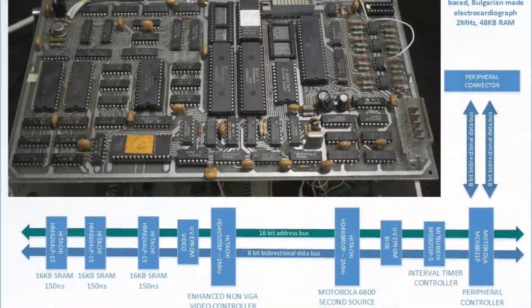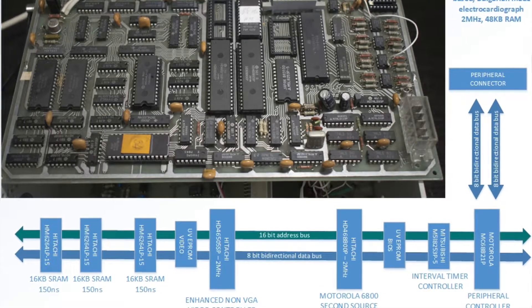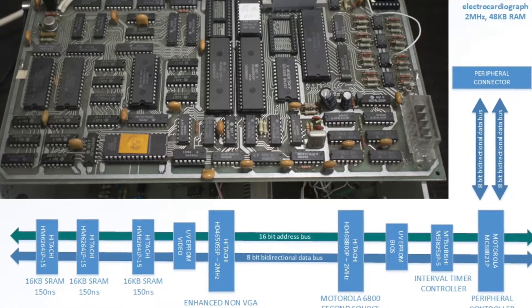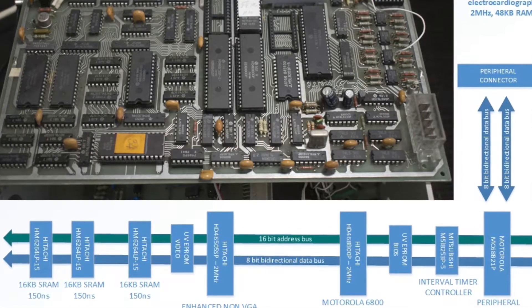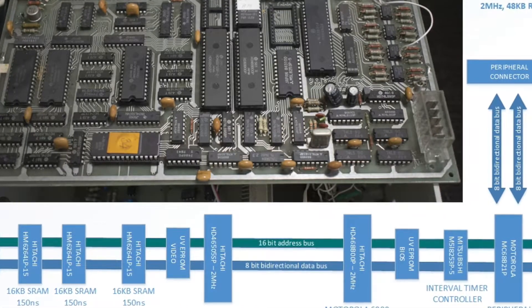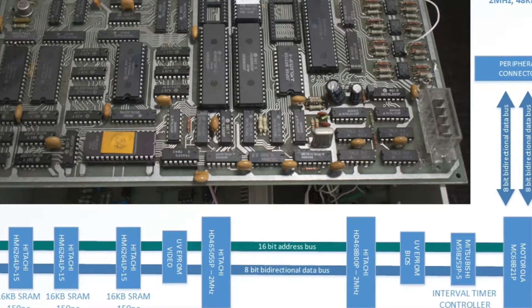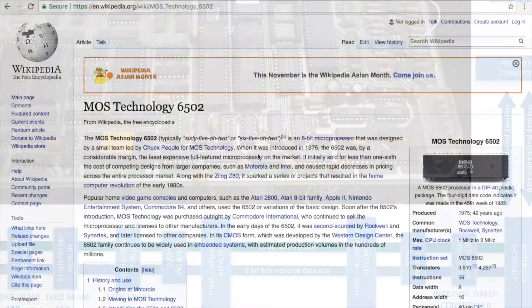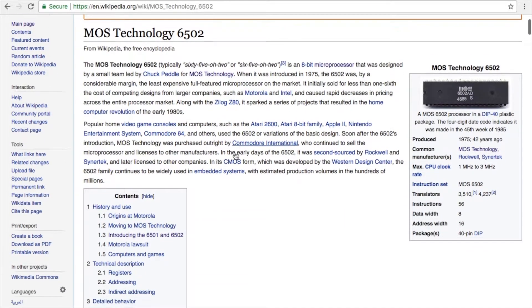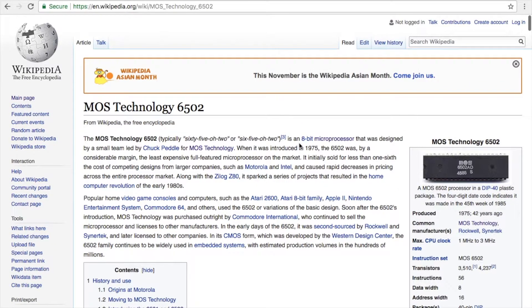The 6800 has an 8-bit data bus and a 16-bit address bus that can address a whopping 64KB of RAM — 48KB in our case — and works at a blazing 2MHz, which makes it at least on paper twice as powerful as an Apple II. Why the Apple connection? Well, the MOS 6502 microprocessor used in the Apple II was designed by people from the same team at Motorola that developed the 6800.